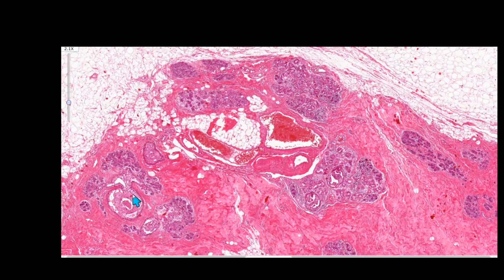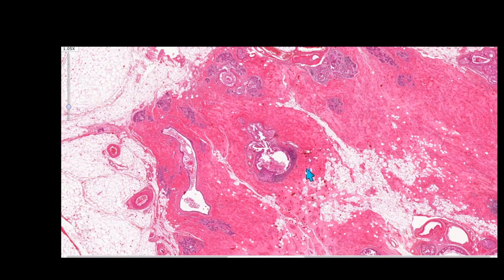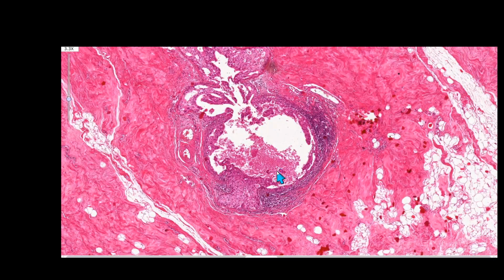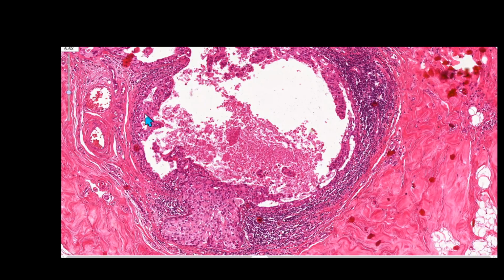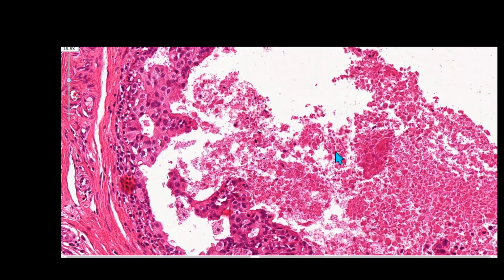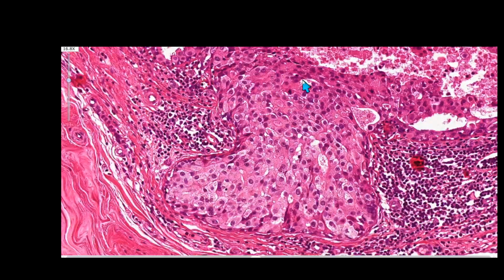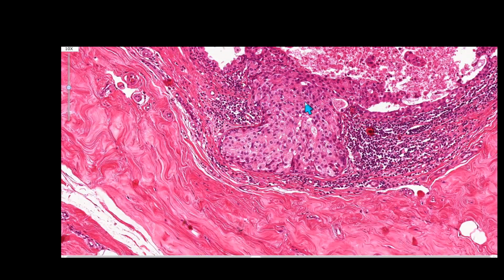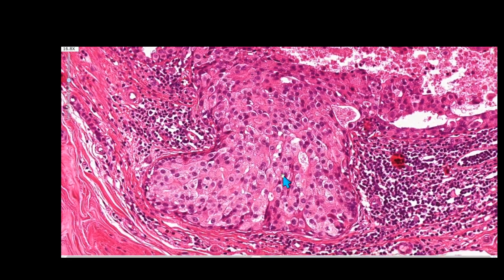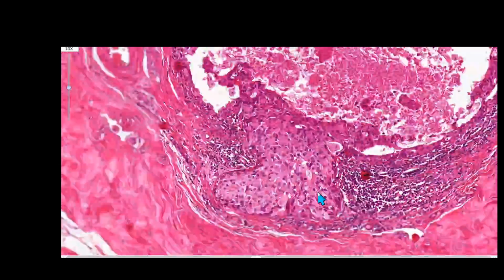And then here I would like to show you two very interesting findings. This is one of them. It's a cross-section of a duct. There are very few cancer cells left within the duct because there is necrosis, apoptosis. What is interesting for my eyes is this exodus. There is a breach here on the boundary, and the cancer cells just flow out like lava does. These are the so-called dedifferentiated cancer cells that can cause so much harm.